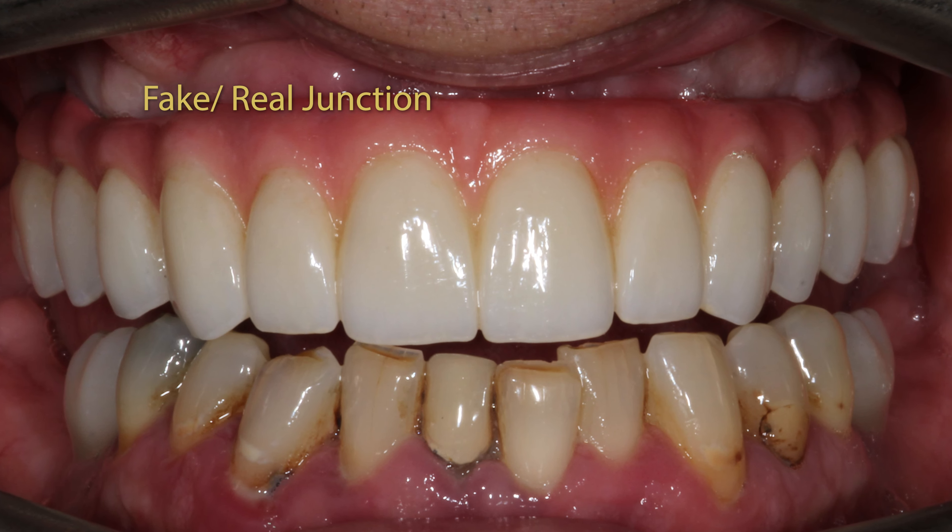Here you can see a photo of somebody who's had this done with their cheeks all pulled back, and it's really obvious where that margin, where that junction is between the real gum and the fake gum. And when we're doing an all-on-four, we pay a lot of attention on how we can disguise this — how can we make sure that the gums are going to cover up this junction?